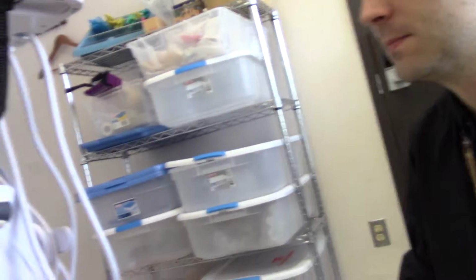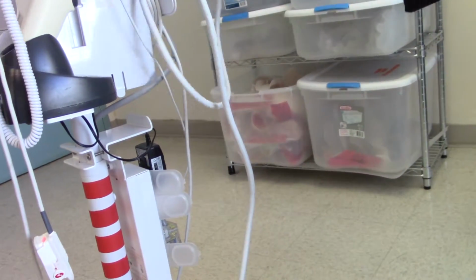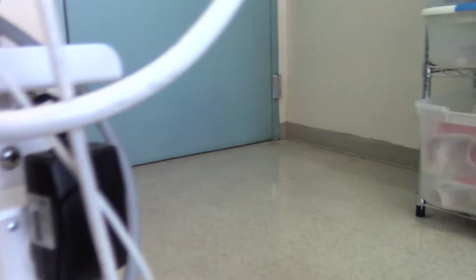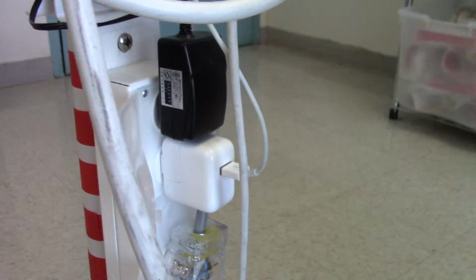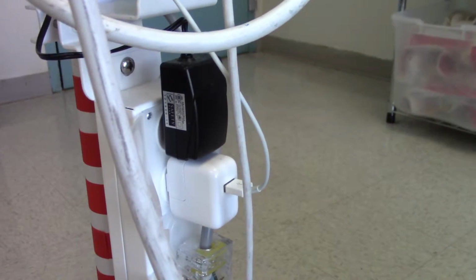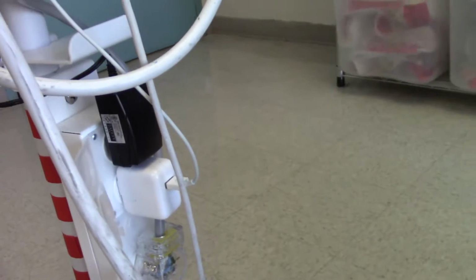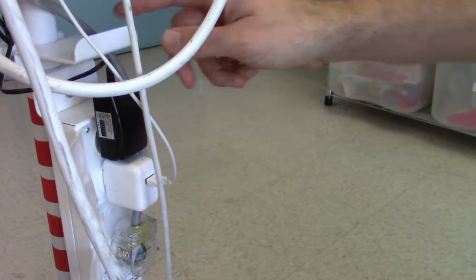I see, okay. Is there any problem with everything remaining powered on? No, I mean, it's powered off, there's no battery backup, so right now it's not plugged in. The only issue I see is besides the Apple charger unseating, occasionally the wall wart here gets broken, or falls off. It doesn't get broken, it falls off. And then on the bottom of the scanner, you can't quite see it on this one, but there's a little right angle plug on the bottom that comes loose. That's really not that big of a deal. We can just walk up and push it in, and I don't think I've had to replace one of these yet. Now, I think I've seen a couple different ones of these. Yeah, I've seen a round one.